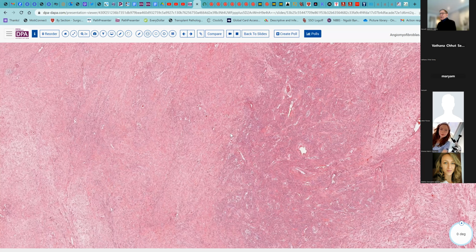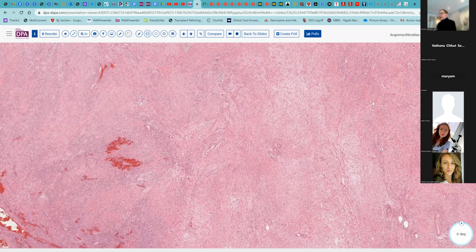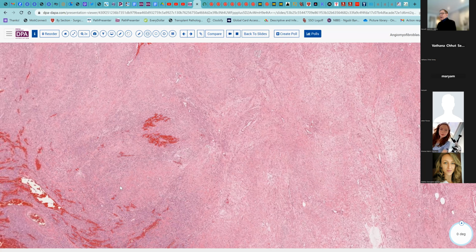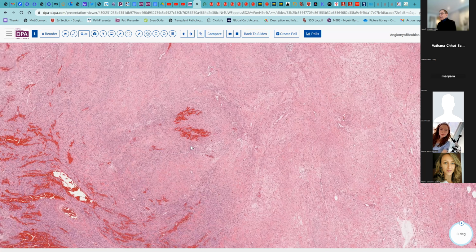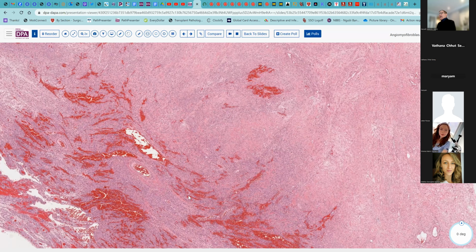So there are some subtle differences here, but there's a lot of similarity in these two lesions that can be difficult when you're just presented with a new lesion. But if you think of desmin positivity, again, these may be hormone positive. That's variable, and these would be HMGA negative in terms of soft tissue differential.